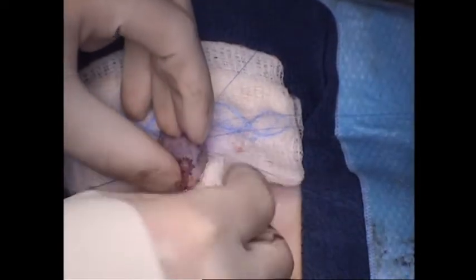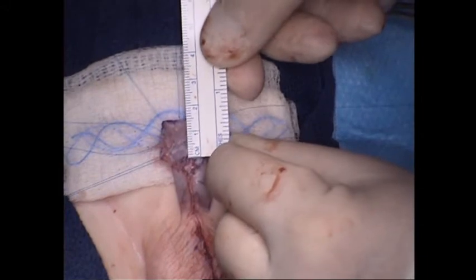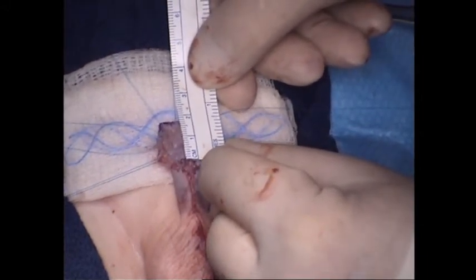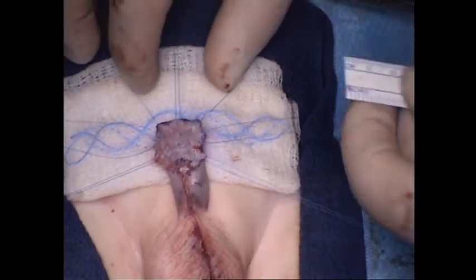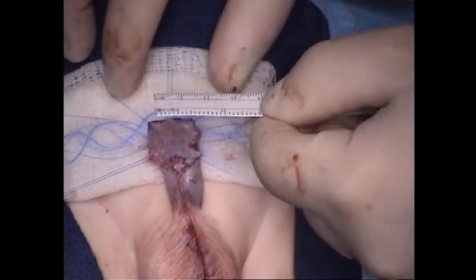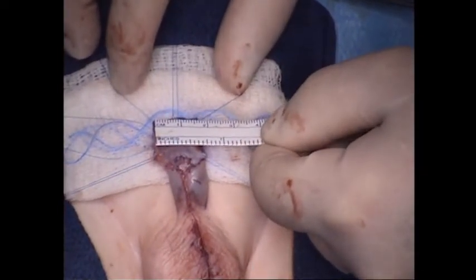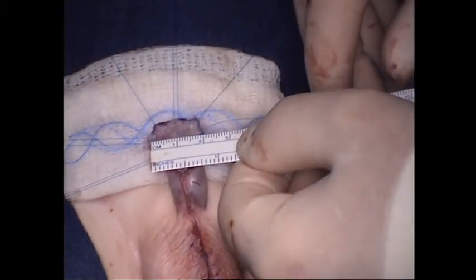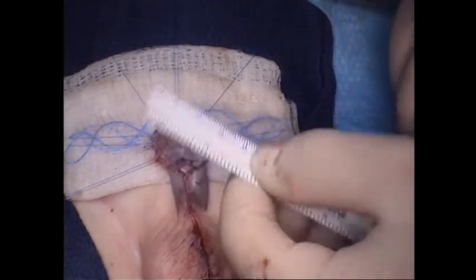The other thing that we do in every case when we're finished, measure the graft and record it for comparison to the next operation. So the graft length in this case is 16 millimeters, and the width, beginning at the corona, will be 16. We'll measure in the mid portion. That's 19, and then at the proximal urethrostomy.